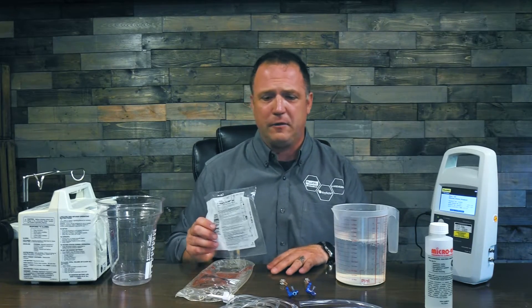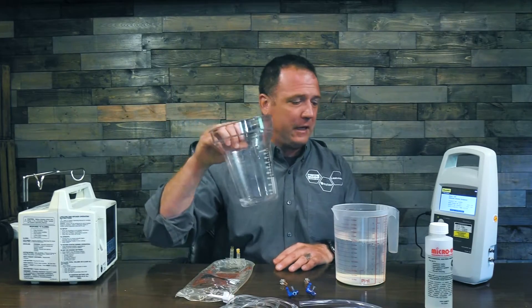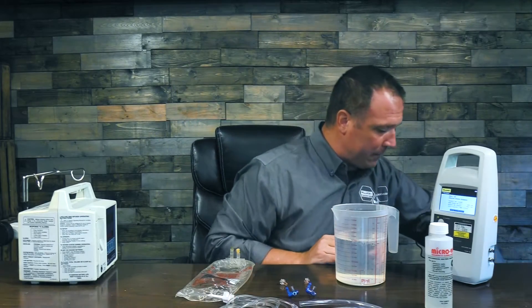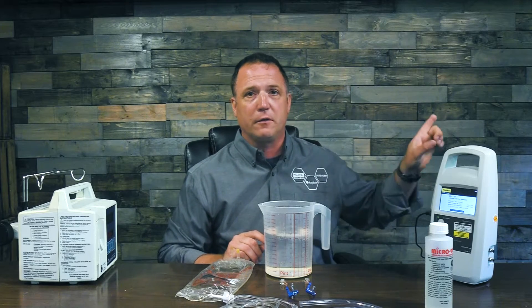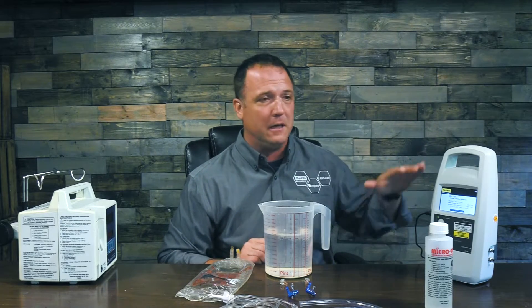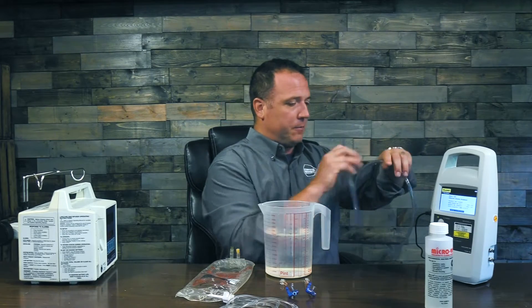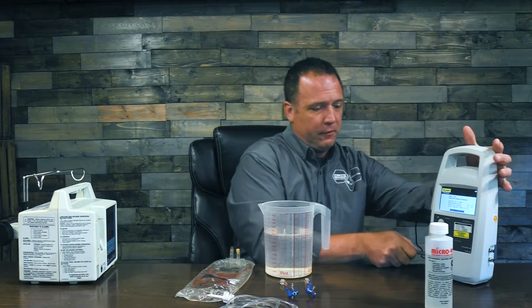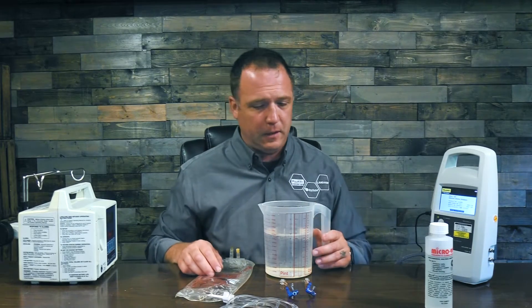Let's start setting this up. The first thing I'm going to do is put my collection canister in the drawer here on my desk. You always want your collection canister below the surface of your infusion pump — you don't want to be pushing fluid uphill as it's going to cause back pressure on the lines. So make sure your collection device is below the level of your infusion pump. Now I'll connect my drain line to my infusion pump and put it down into my collection canister.